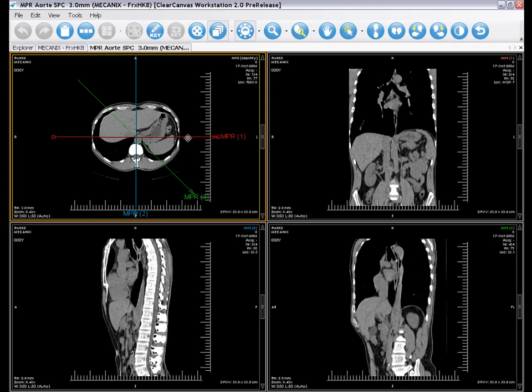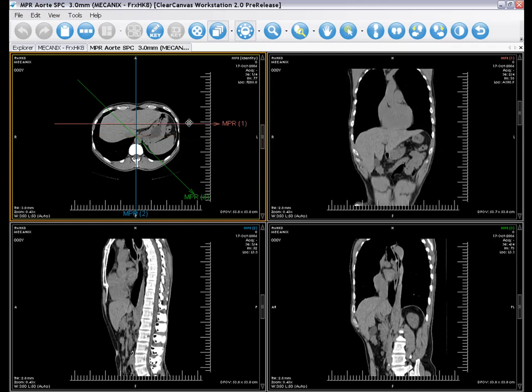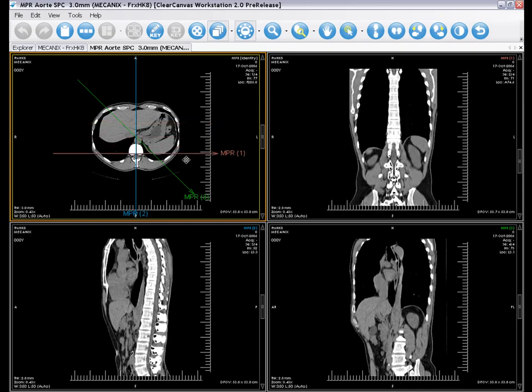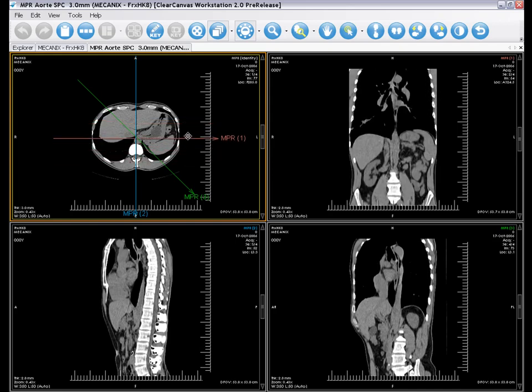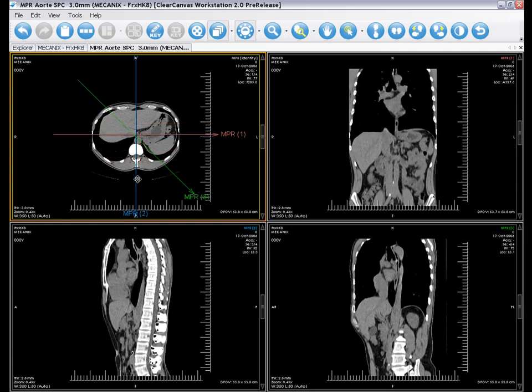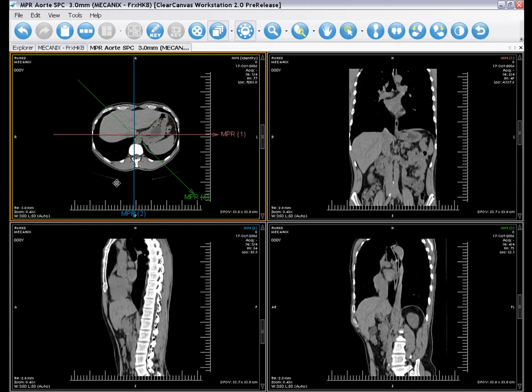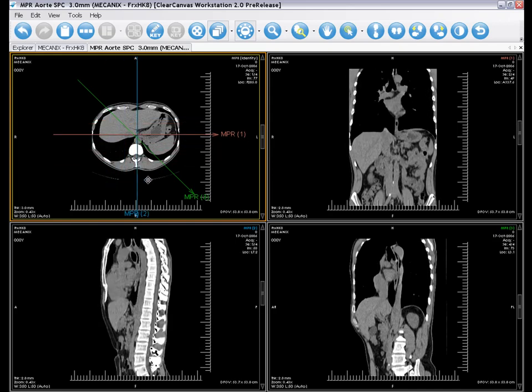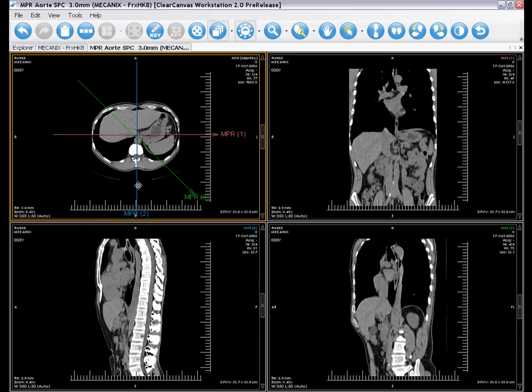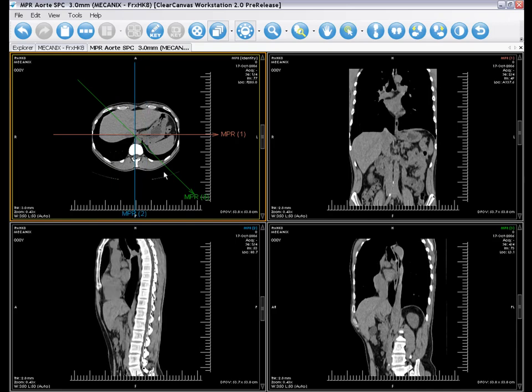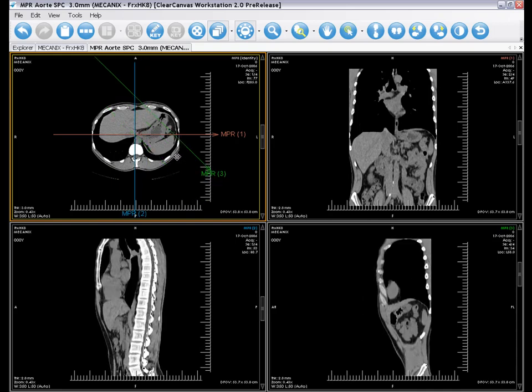In this case, the first is coronal, the second is sagittal, and the third is a 45-degree oblique.